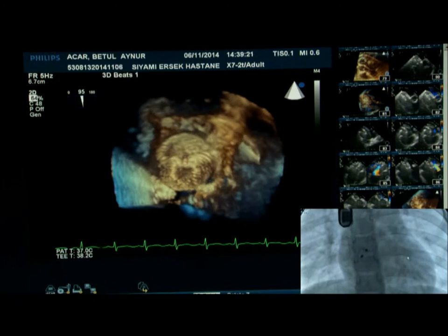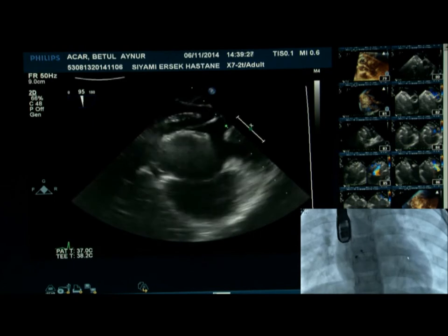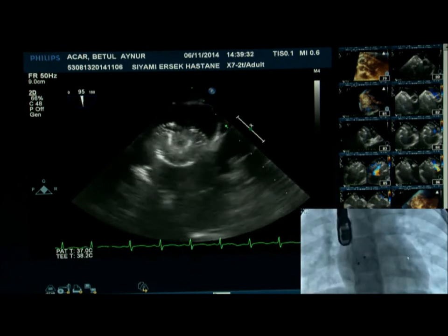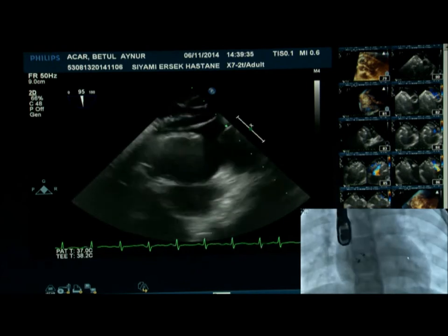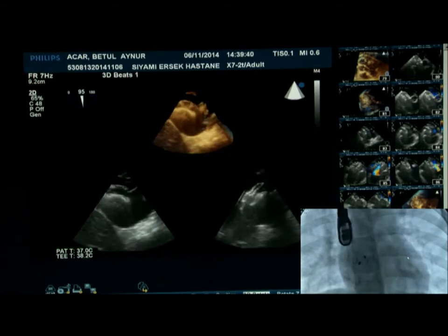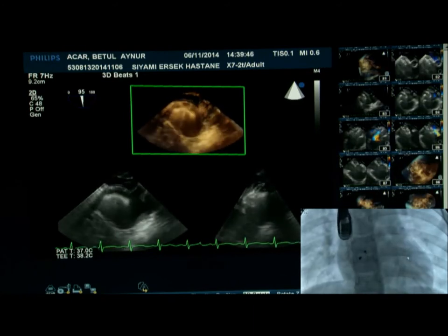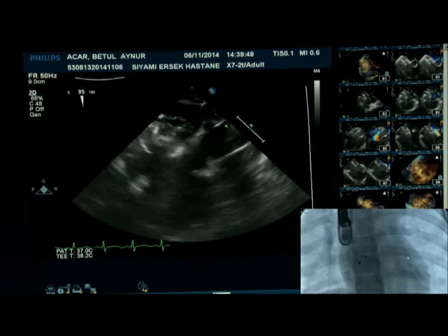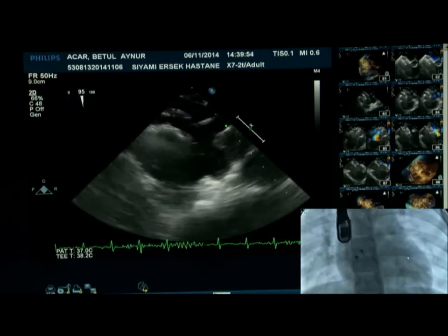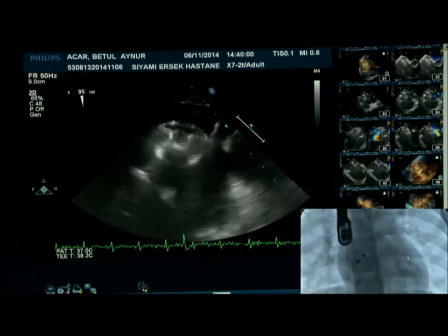If I understood it correctly, the reason why not use other devices? So you would have a choice of Occlutech, and Occlutech has a very similar waist if you're using the regular atrial septal defect device. We are talking about the Flex system. Yeah, the Flex system is still, the discs are the same. It's just a flex allowing you angulation. The same happens with the Seraflex. It's got a little bit better angulation, but the discs, the shapes and everything else are fairly similar. So you can use, as I said before, any of those devices.